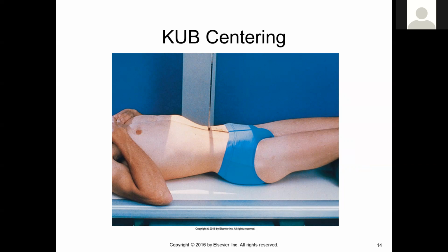We are centered to the crest, here and here. Light going down to the pubic symphysis, which you cannot see, but if you could palpate the greater trochanters, they would be included. This patient should have a lead shield. This is a male patient, but a lead shield just below the light. It will not be blocking the pubic symphysis, but it will protect the gonads.